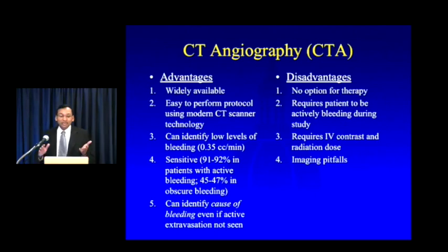So, putting all that aside, we've talked about 4 modalities, and I've given you a sense for why I think they are not the optimal initial test to perform. Now let's talk about the test that I think should be the initial step, and that's CT angiography. Now, let me preface this by saying that we started doing these studies widely at Hopkins maybe about 3 years ago, and I first thought it was ridiculous.